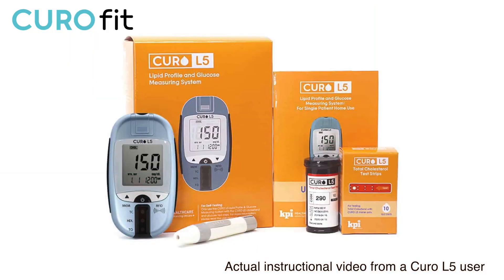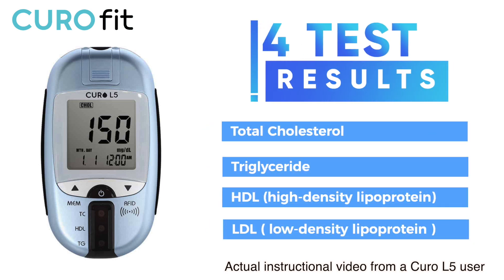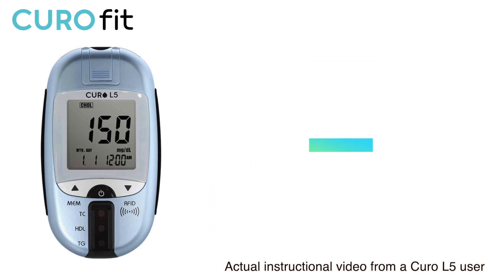In this video, I am going to run you through the procedure and how to test your total cholesterol, triglyceride, HDL, and LDL using the Curo L5 device. I purchased this Curo L5 device and these profile test strips online at CuroFit.com.